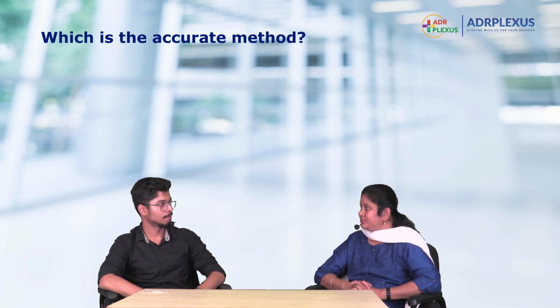The gasometric method and the cyanmethemoglobin method using Drabkin's reagent, ma'am. Good. The gasometric method, done using Van Slyke apparatus, is quite time consuming. It is the ideal method, but the routinely used accurate method is the cyanmethemoglobin method. Okay, fine. This ends the hemoglobin estimation.